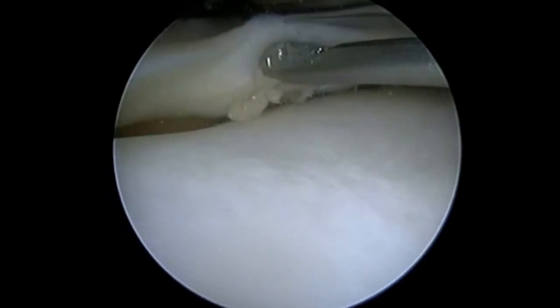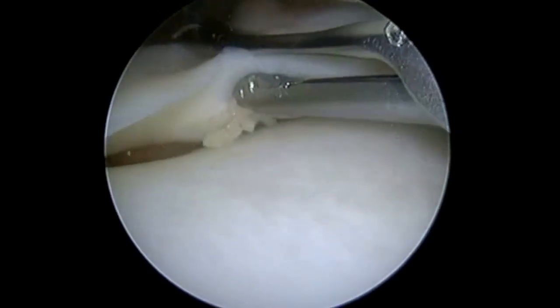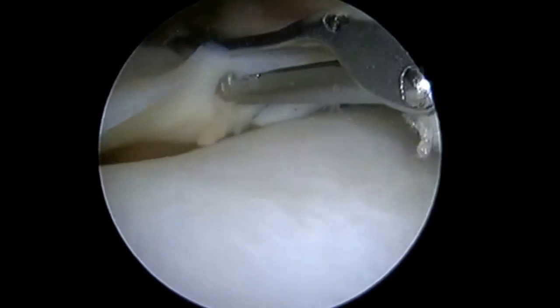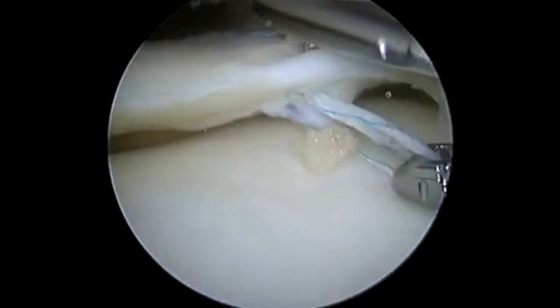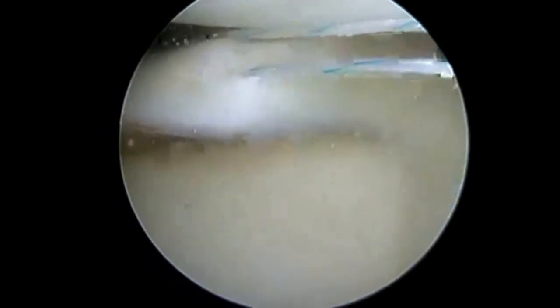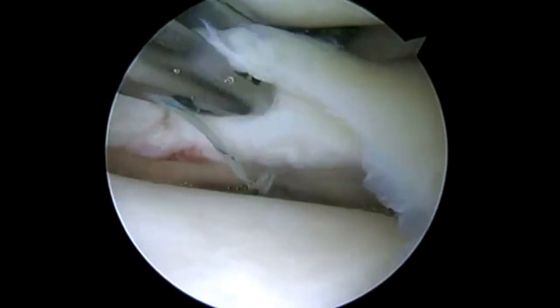With a circumferential stitch, I can reach all the way around this meniscus and compress all the tears. If I were to be using a meniscal fixator device, if I put one of those implants through that horizontal split, then I fail to actually close down the tear. Maybe it will heal if I get just part of the meniscus opposed, but if I can get the entire meniscal tear reduced, then I have a much better chance of healing.